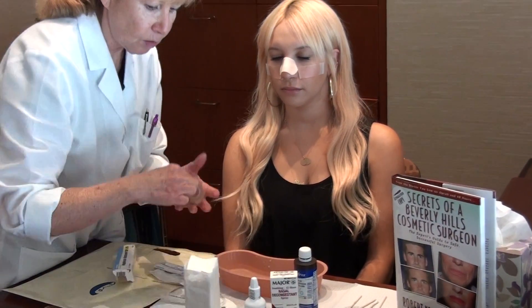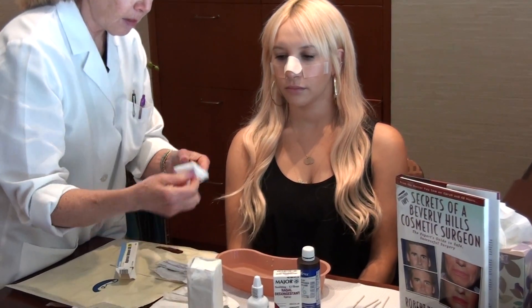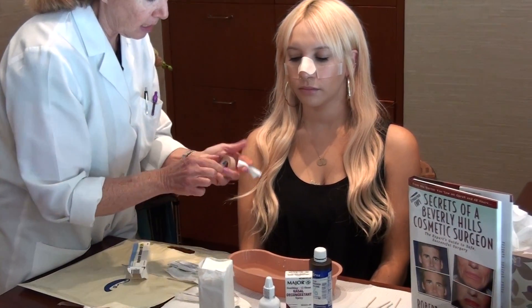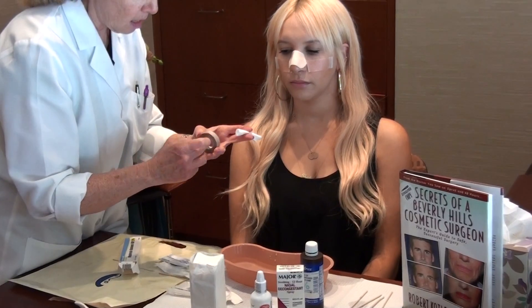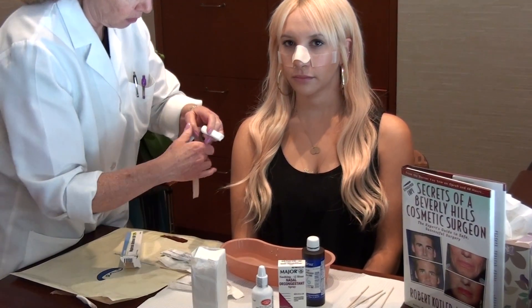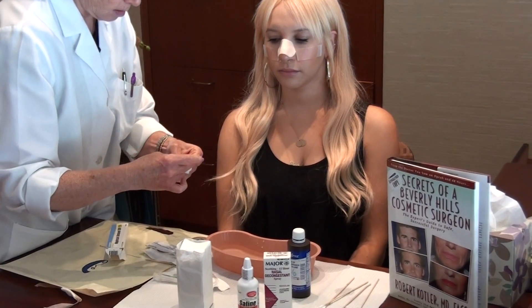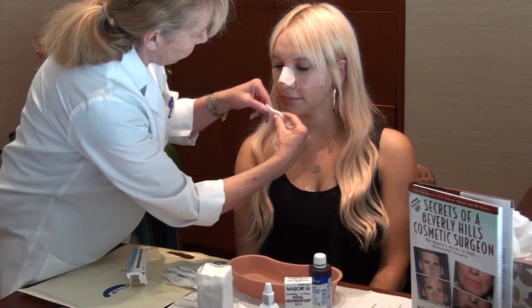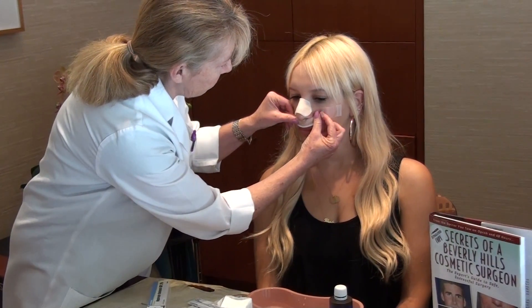When you're through doing that, take a piece of gauze. You're going to fold the gauze up and put the tape in front of it. You're going to tape it onto the tape that's already on your face that you haven't taken off — just put it down like this. And you're clean for another little while.